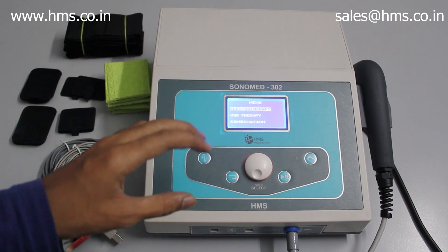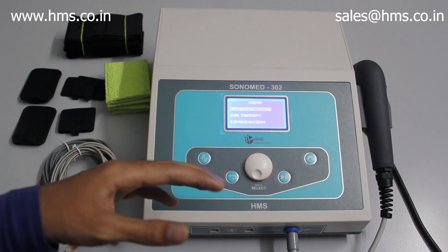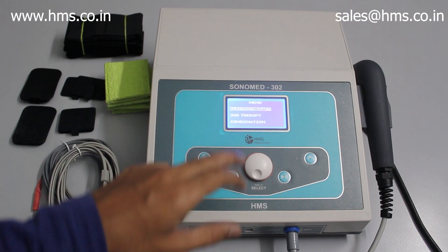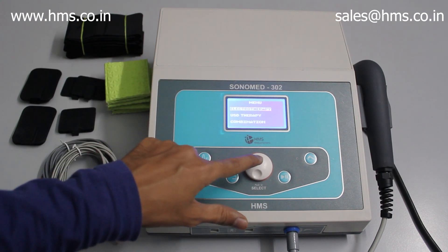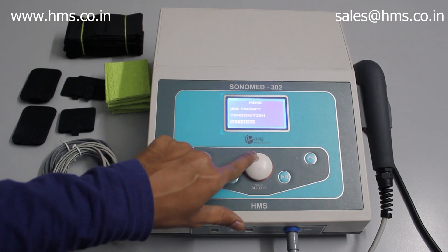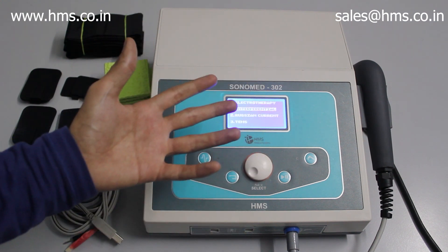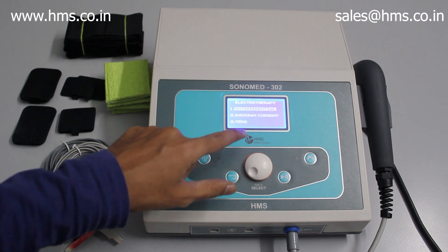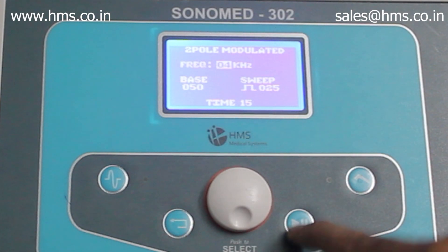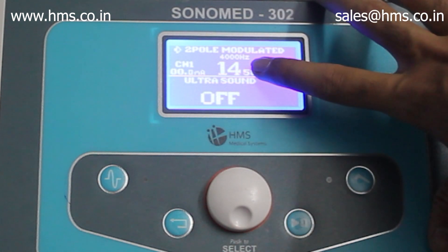Now let's get into the working of the Sonomit 302. I'll first demonstrate how to use both electrotherapy and ultrasound at the same time, starting with electrotherapy. The switch in the middle is used to navigate between menus, and pressing it acts as select. I'm going to electrotherapy, selecting IFT, pressing the start button on channel 1 — electrotherapy is now running.